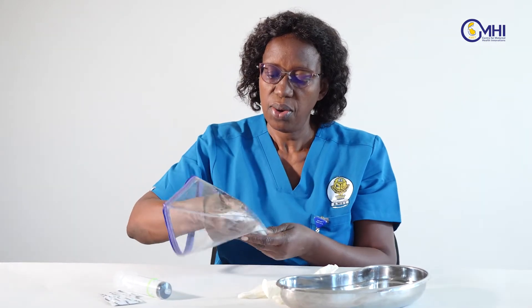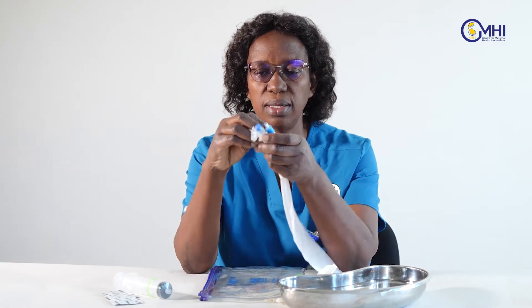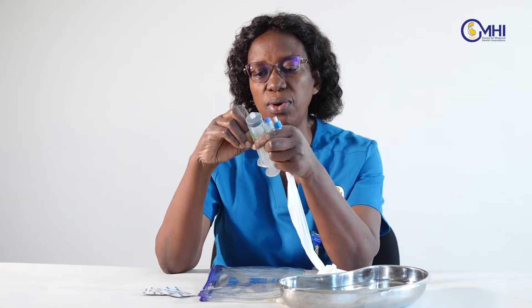In this ziplock bag we have a few components of the balloon tamponade. We have a foley catheter which has two parts covered with a lure lock. There are two valves, a 60 ml syringe, a pair of condoms, and O-rings.